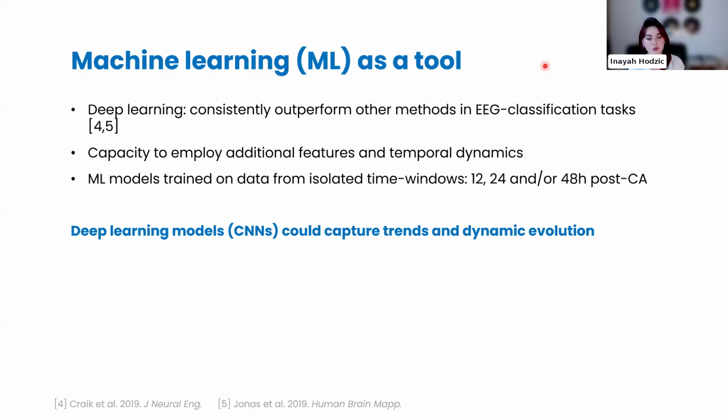So that kind of evolution of the EEG signal is a very important part of prognostication. And in some cases in practice, such specialists don't even have time to scroll through an entire EEG signal, even if they want to. And as such, it often becomes restricted to these 12 and 24-hour periods.